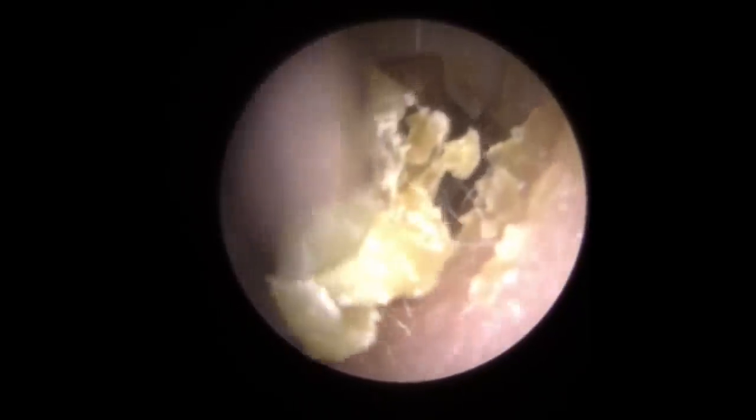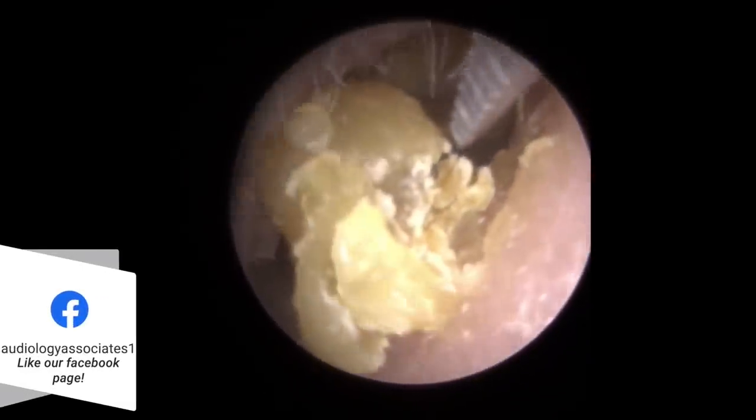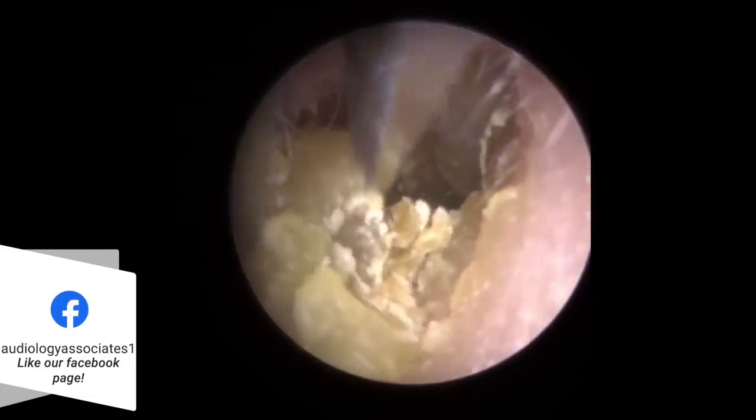It really kind of adheres to the canal wall. Just pulling that section — now we've lifted that, you can see it's quite a long section. Trying to hold on to it with the standard size suction tube but can't quite get a grip, so we're going to bring the crocodile forceps into play again. You can see it's a slightly softer texture at the top, so some pieces are a little bit drier than others. We'll get a good grip on that — you can see that piece coming away, it's quite a long section.